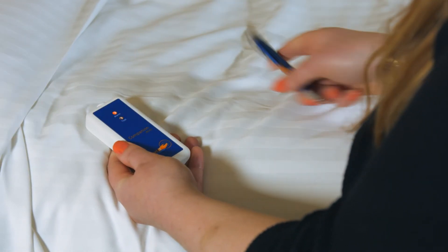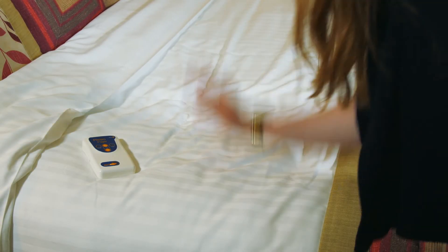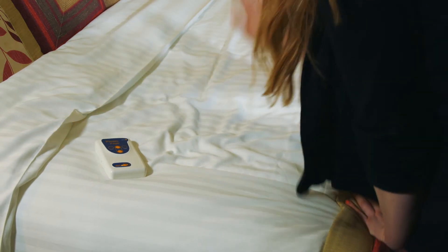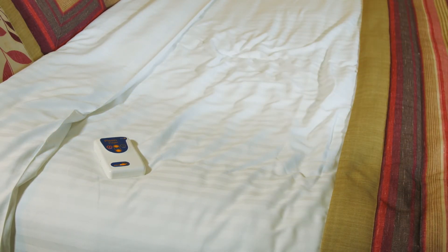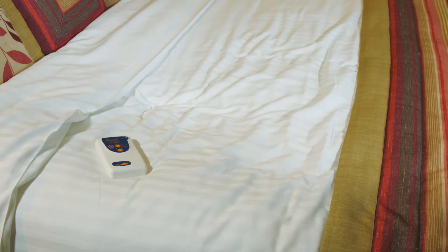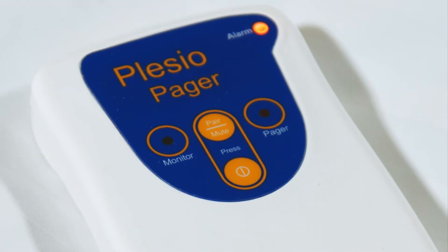Press the Test button again and then place the monitor under the mattress — it is best suited directly beneath the user. Again, tap on all areas of the mattress, causing the Pager to beep and the red LED to flash. The test period will last for 60 seconds. When the test mode lapses and you are happy that the monitor detects the movement, tap on the mattress continuously until the Pager alarms.